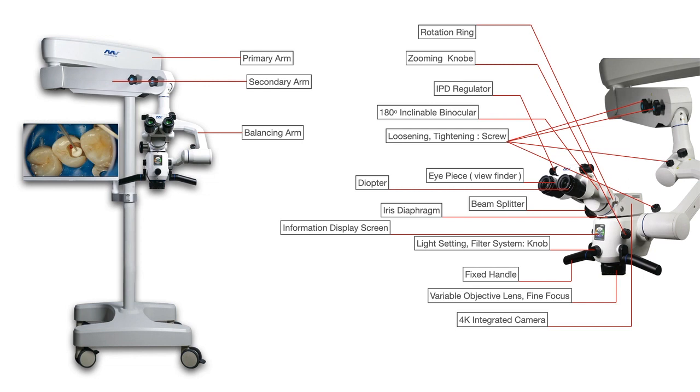This is what I talked about at the beginning of the slide. Another screw is the balancing screw. The balancing screw is responsible for balancing the arm, not loosening and tightening the arm. It is all about the balancing of the arm.